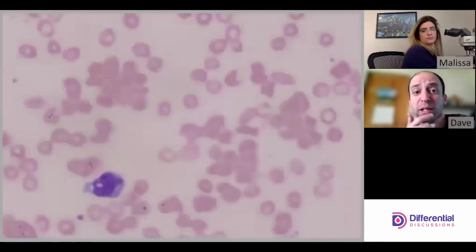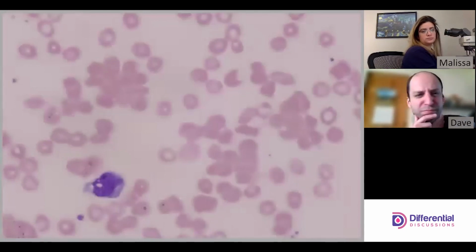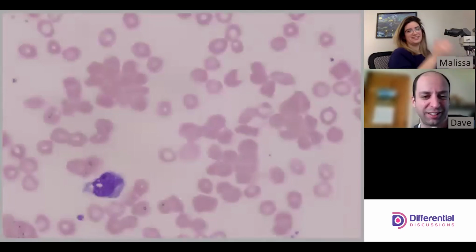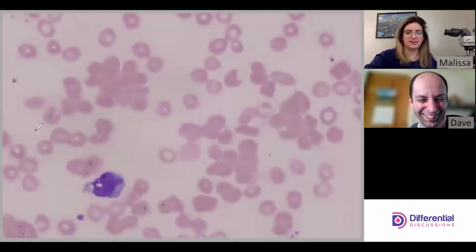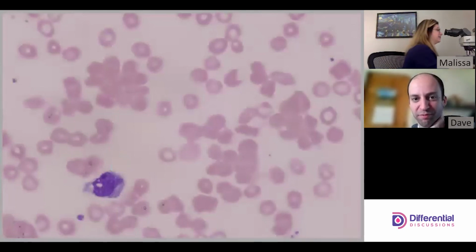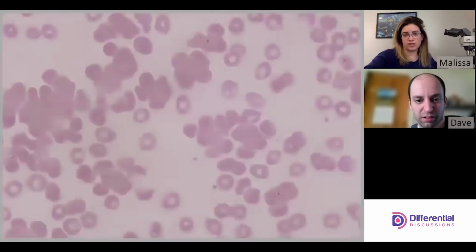And sometimes it can be quite subtle, right, Melissa? Yeah, definitely seen agglutinations that are subtle. There's a mono here. And then a bunch of agglutination. All right, let's go one more. It's more agglutination.